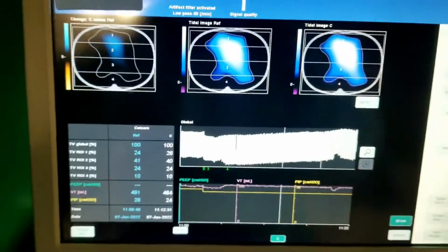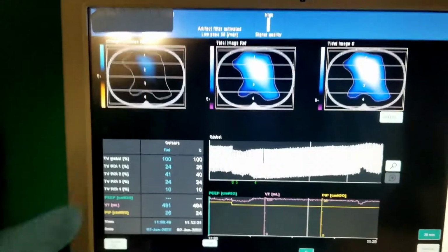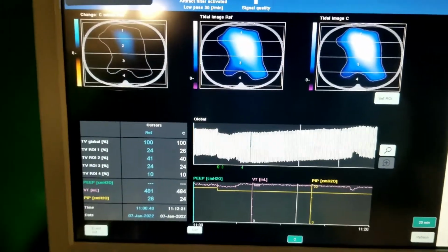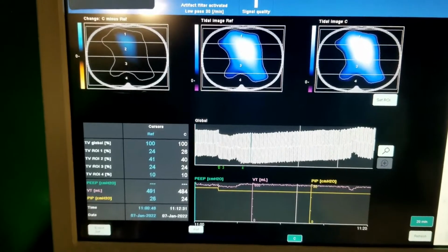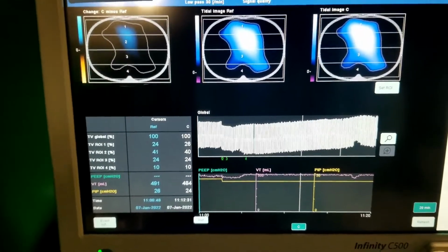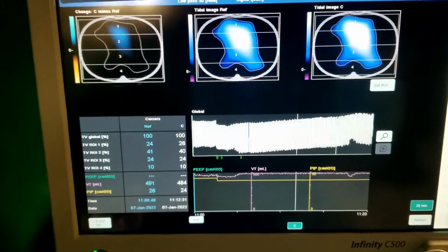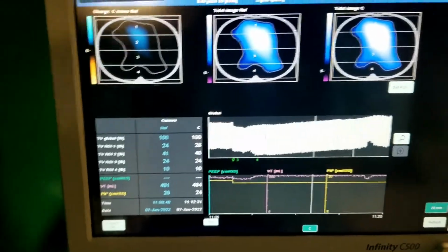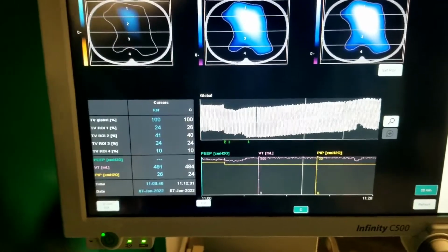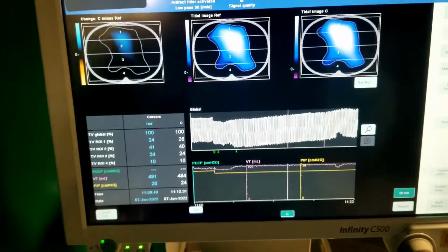So think of it kind of like this way. You know, when you're in ACPC, and let's say you are at 28 of peak inspiratory pressure on ACPC, and then you drop it to 26, and the tidal volumes remain the same. You're like, oh great, I'm getting the same tidal volume with less pressure. You drop it again, let's say to 24, and the volume actually increases now with that pressure. So you know that you're in a more compliant area, right?